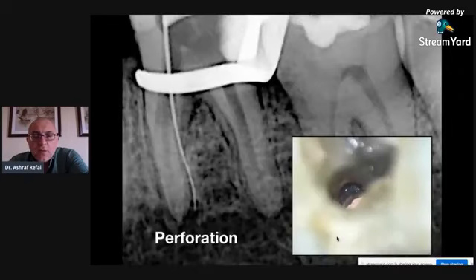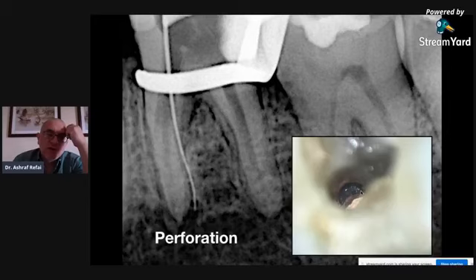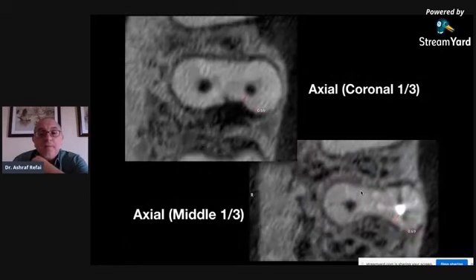But when I took a closer look, I realized that during my retrieval, I actually perforated into the furcation area, and you can see very clearly here on this picture this mouse hole appearance. You can see the perforation laterally, that's inside the canal, and that's corresponding to the X-ray that you see and the position of the perforation that you see in the X-ray. But generally, I knew that there was a risk for this. I didn't show you that, but I knew that there was a risk for this. That's why I always take my CBCT scans.